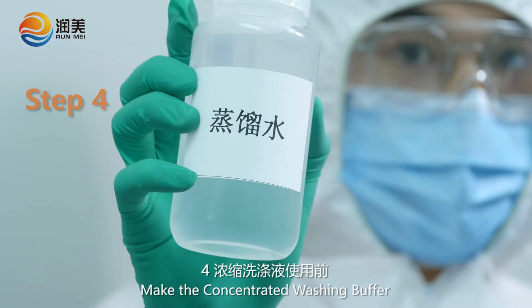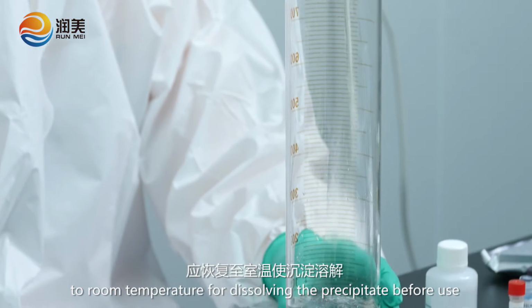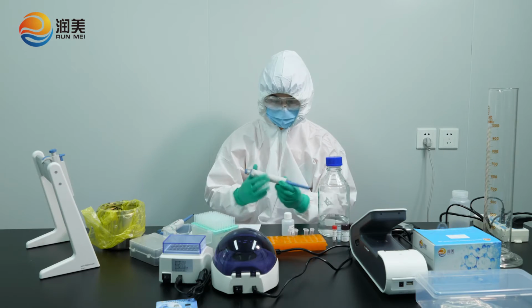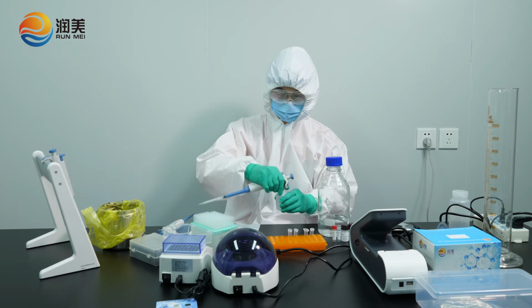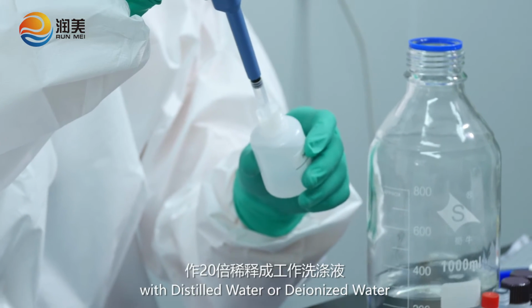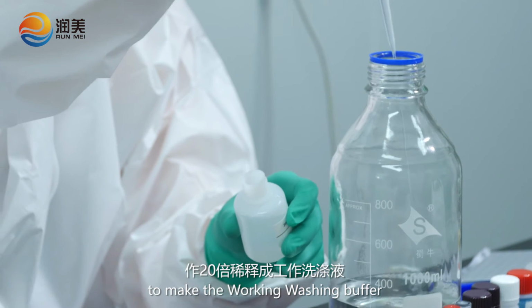Bring the concentrated washing buffer to room temperature. Check for precipitate before use. And then dilute it 20 times with distilled water or deionized water to make the working washing buffer.